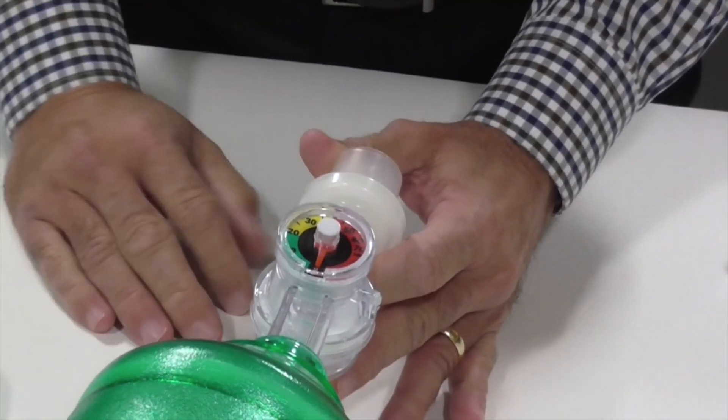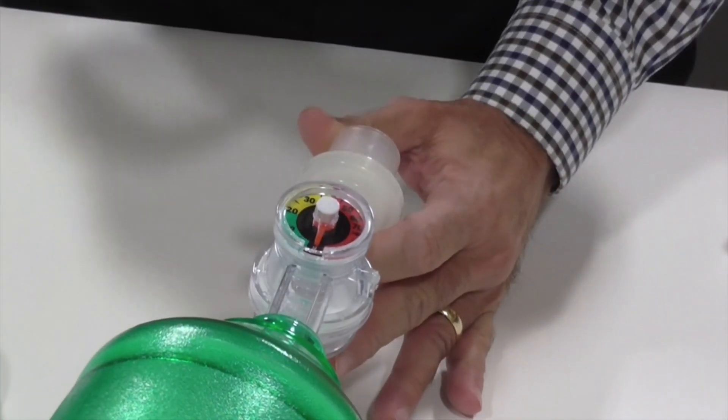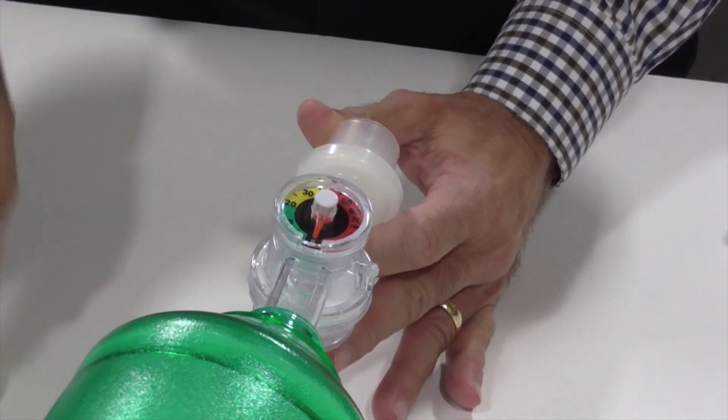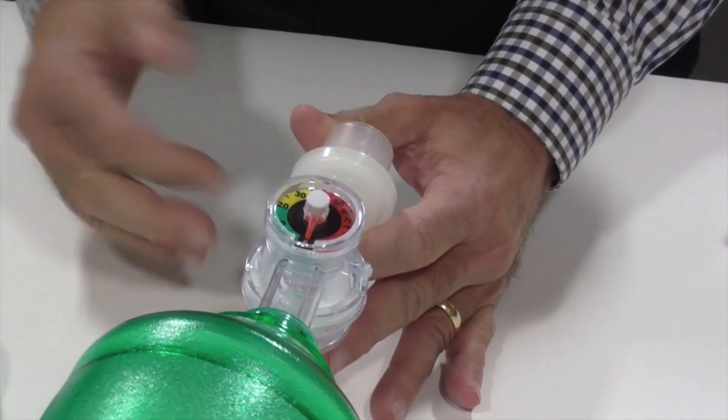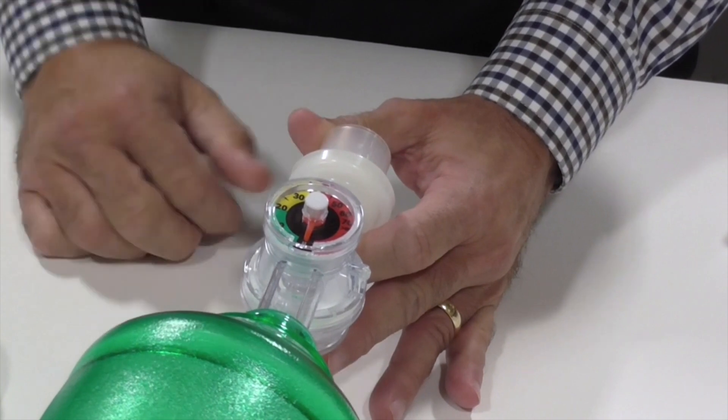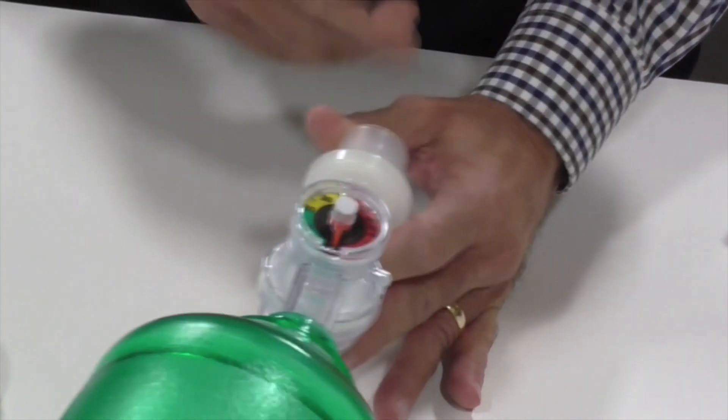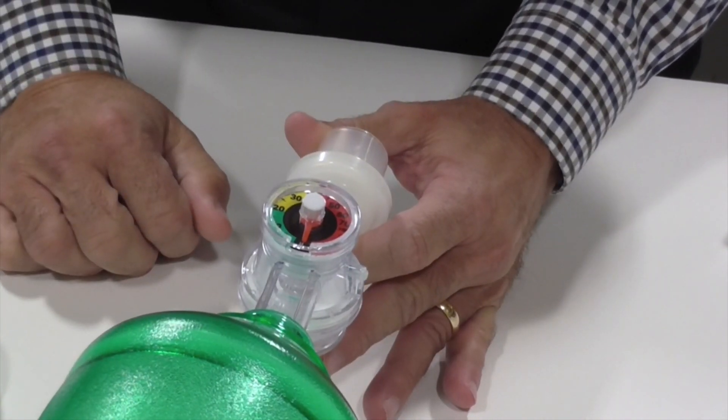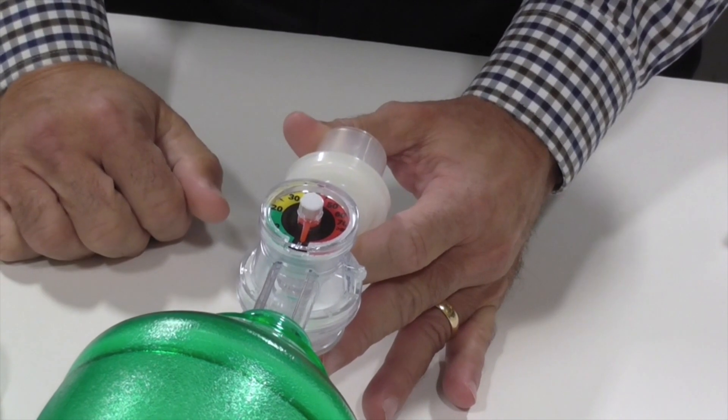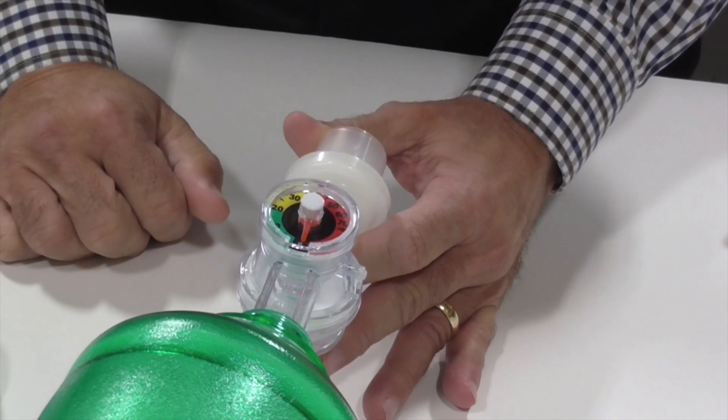The manometer is going to tell you how much pressure you're bagging with, which is very important, especially if I'm mask bagging a patient. This will help me prevent gastric insufflation, which can cause vomiting and aspiration. So I can limit how much pressure I'm using during mask ventilation.